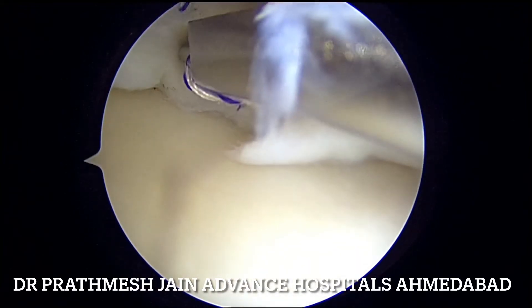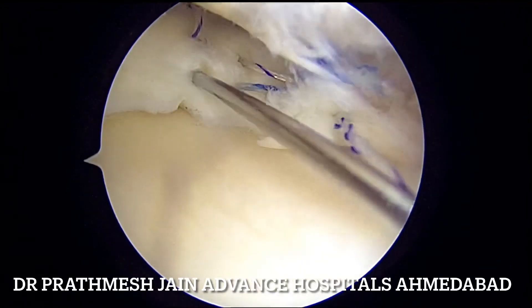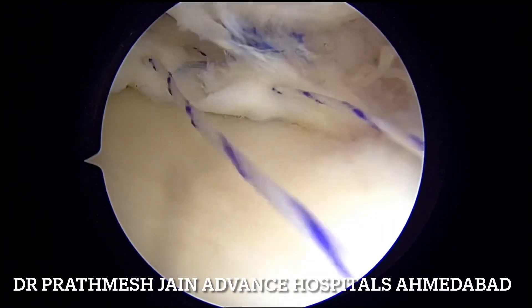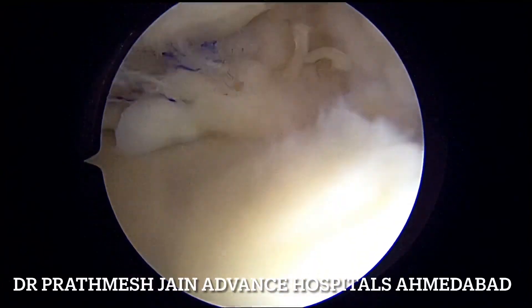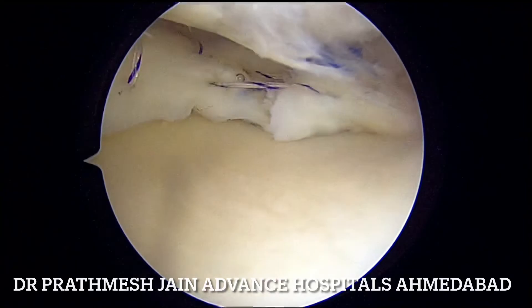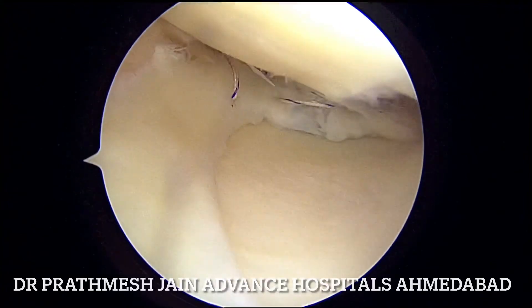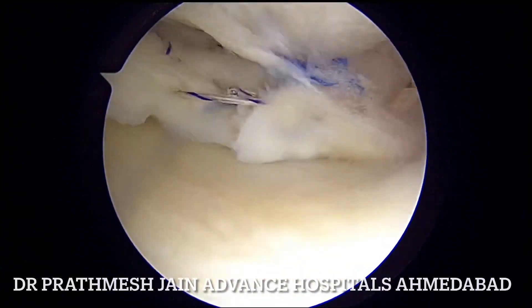In this particular case we have used a single root fix anchor and around six inside-out sutures. This leads to a very nice closure. You can see that in the end the meniscus tear is reduced very nicely from the posterior to the anterior aspect. Even though the tear was bucket handle along with complex and radial components, it can be reduced nicely if we follow the principle and use these innovative techniques.